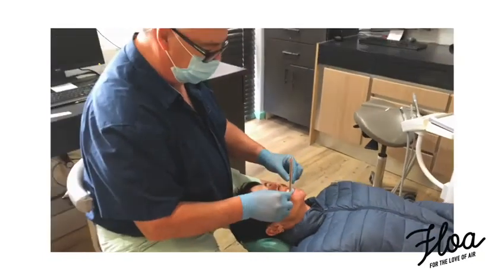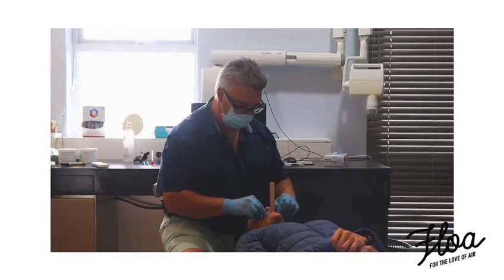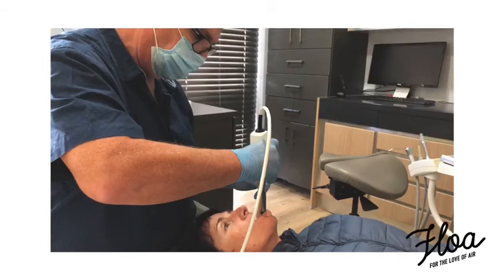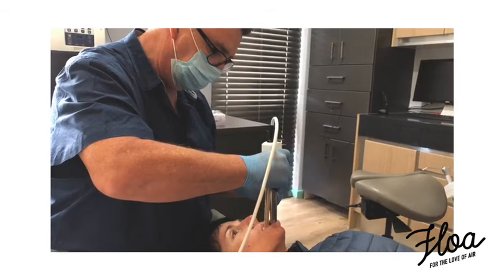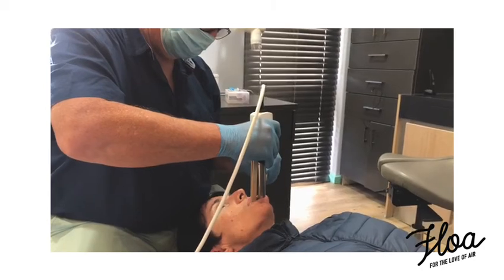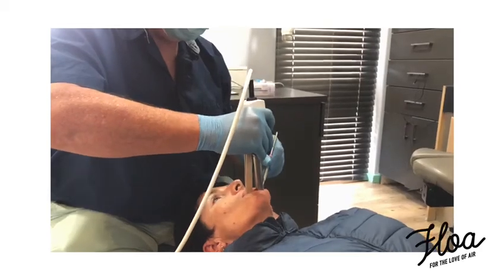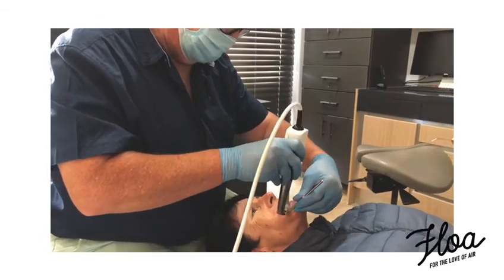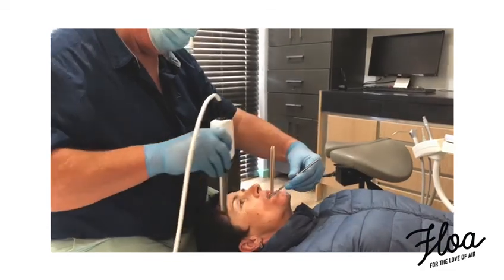Obviously you can use the same thing and put a roller of putty there and take a bite if you're doing the whole thing analog. But the digital age is upon us, and then we get over into scanning. In this case it's just a matter of scanning the buccal corridors and getting your bite locked in. If your scanner battles to do this right, start at the front, get a little bit of your stick and the putty in, and then scan backwards — it tends to keep the reference a lot better. Then obviously we go into the other side. You see the patient pulls her mouth, and that's why it's important to have the teeth locked in — otherwise that pull will distort the position.